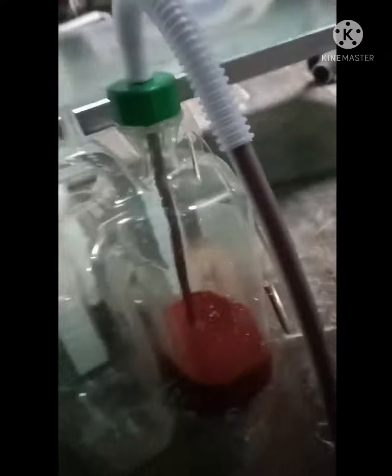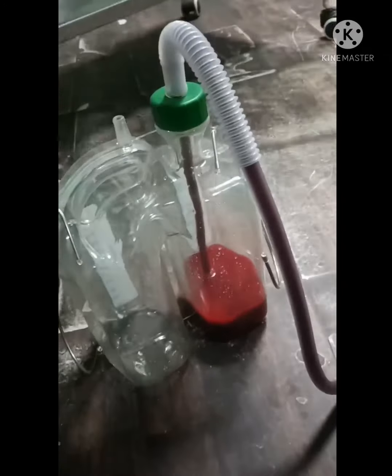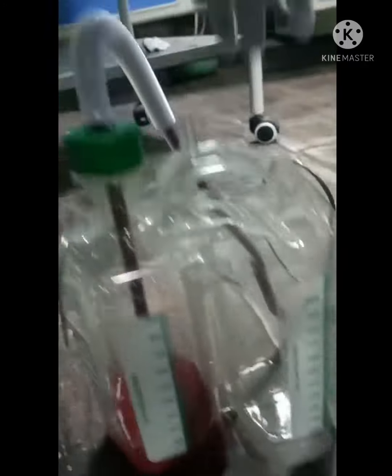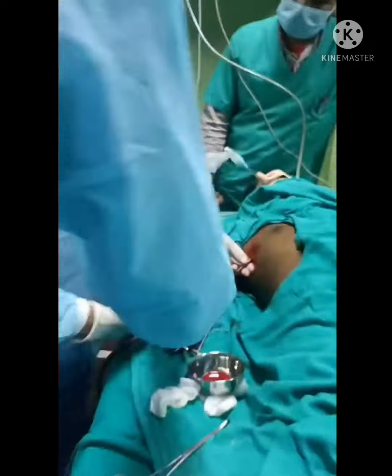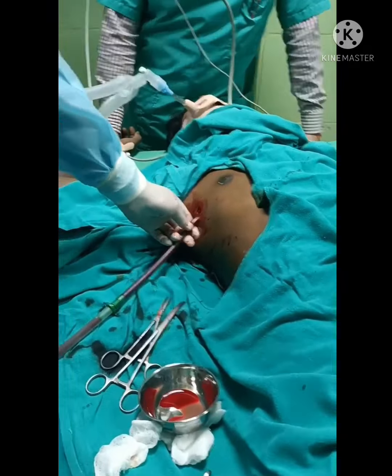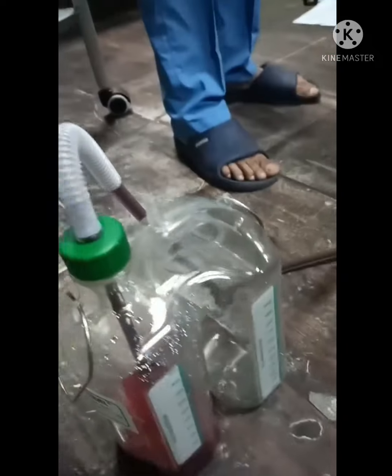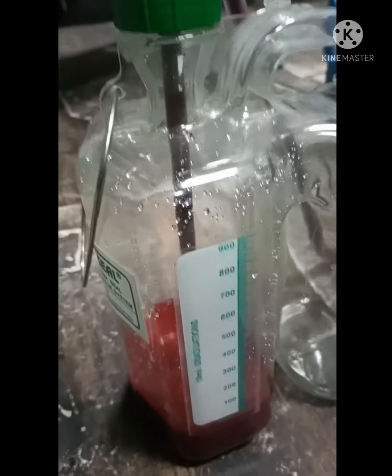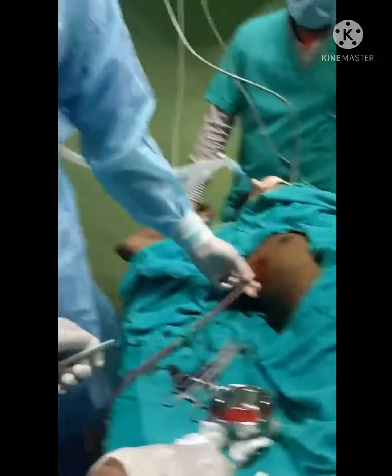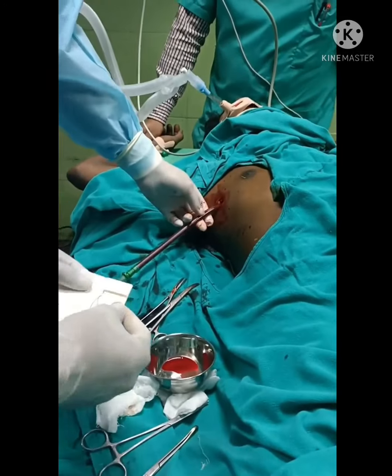Now you show the collection. Show the line here. Now we'll stitch the chest tube to the wall. And just see if there's a movement. You have to be doubly sure that there's a column moving. Yes, yes.